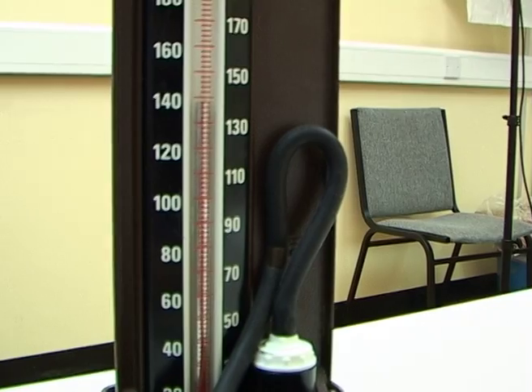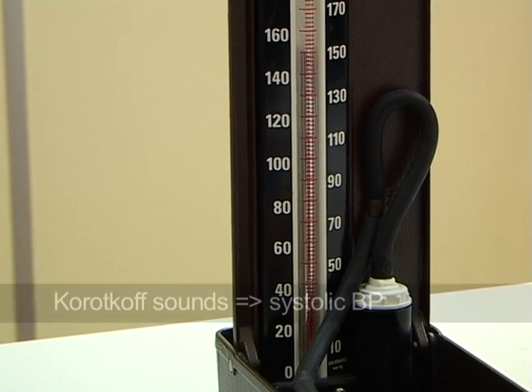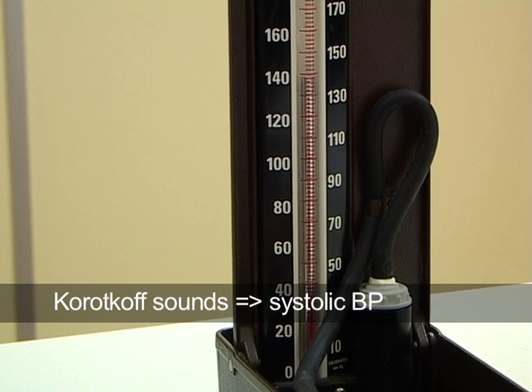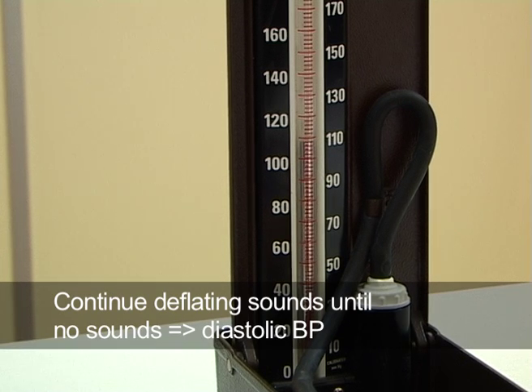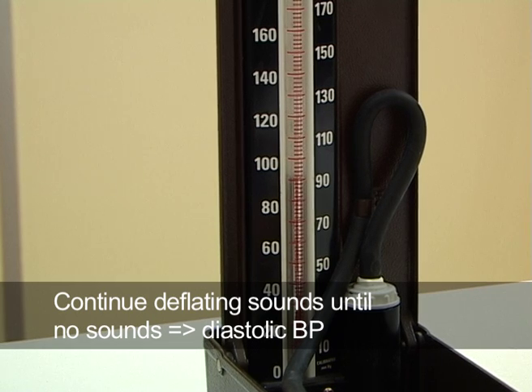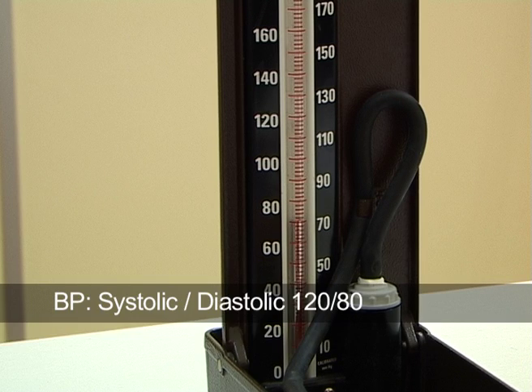Start deflating the cuff very gently until the first sounds are heard. As the blood starts to push through the deflating cuff, the turbulent blood flow produces the Korotkoff sounds followed by the systolic sounds. At this point, you need to note the systolic pressure. Continue deflating until the sounds gradually disappear. At the level where nothing can be heard, you note the diastolic pressure. The blood pressure is recorded as systolic over diastolic, such as 120 over 80.